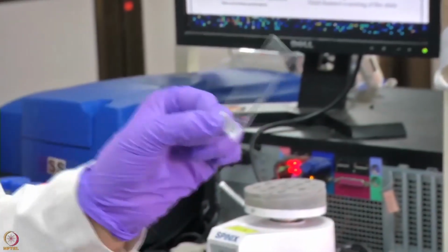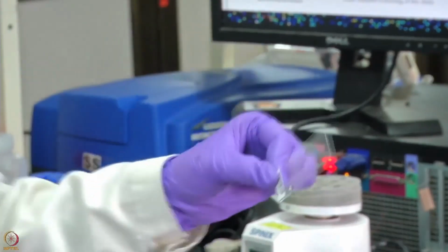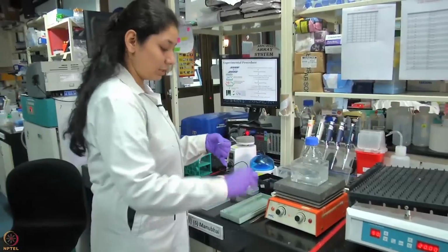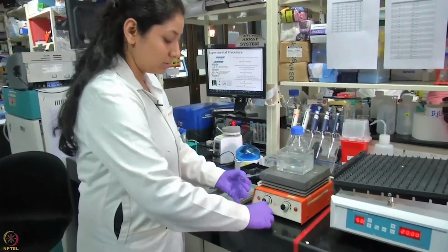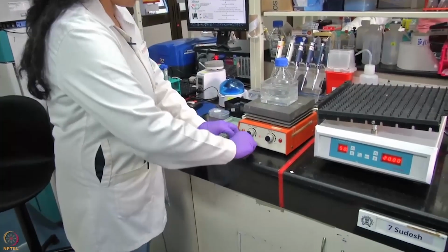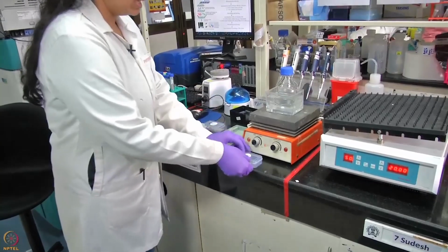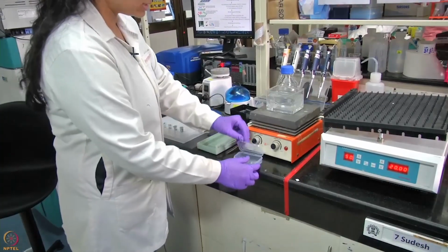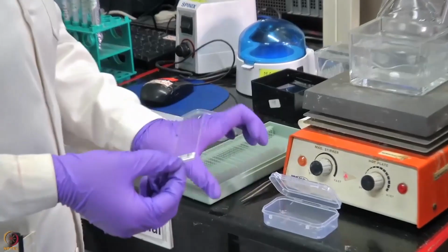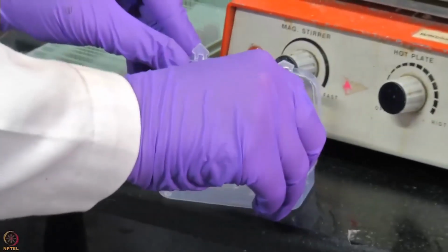This is one of the precautions, otherwise fingerprints can result in erroneous results. So this is one of the slides which I am taking, and I am putting it in this box. This is another slide. I am showing 2 slides that can be screened together for screening 2 different patients.